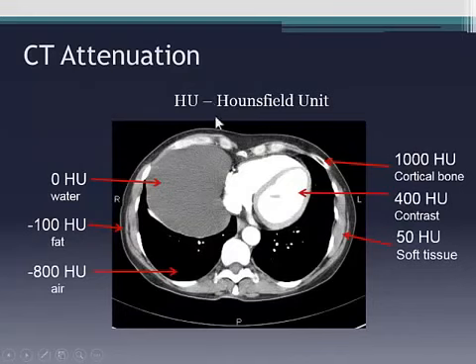Okay, so Hounsfield unit. You've already heard that the Hounsfield unit is just a way of quantifying the CT pixel value. Zero is water, plus 1,000 tends to be bone, and minus 1,000 tends to be air. Obviously, there's a range of numbers between that. Why it's important is that although the gold standard for tissue characterization remains MRI, CT can still give you very important information as to tissue characteristics, albeit not to the same resolution.